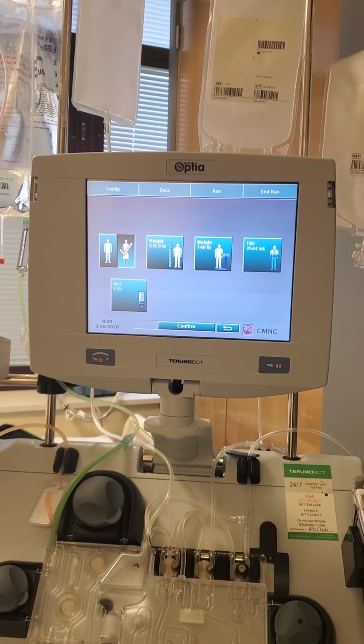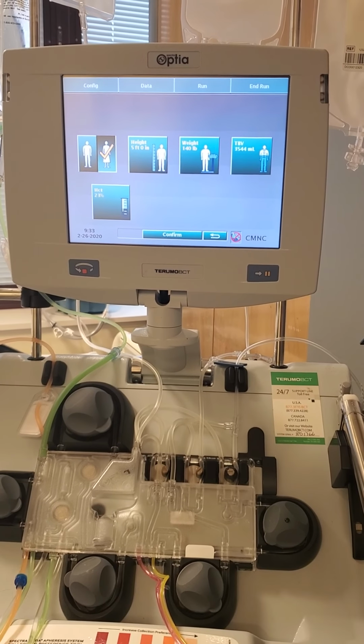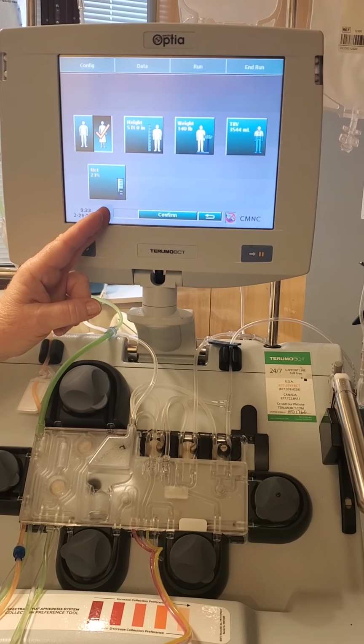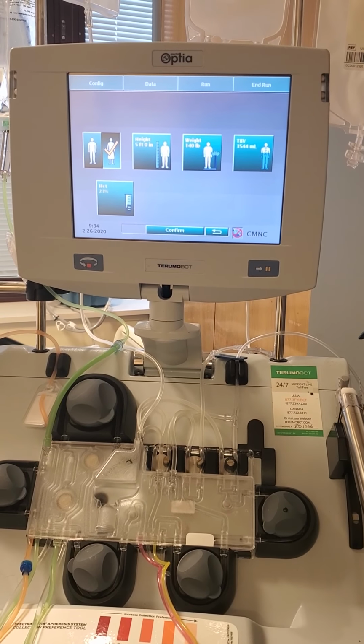It is the plasma pump's main job in life to control and establish the interface position. You cannot do an apheresis procedure without an interface. This is the most critical piece of data for the formation of the interface. That is the piece of data that's used first, the hematocrit. And then finally, AIM wakes up, becomes active, and takes over the monitoring and controlling of the interface position, adjusting the same pump flow rate, the plasma pump flow rate.